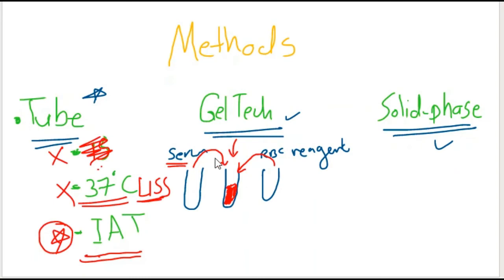So they add the serum to the red blood cell reagent, incubate them, wash them, then after incubation, they add Coombs serum. So if the unexpected antibody is present, the anti-human antibody will cause agglutination. So we call this the indirect antiglobulin test. This is the mandatory one.